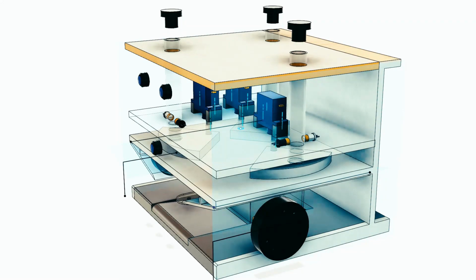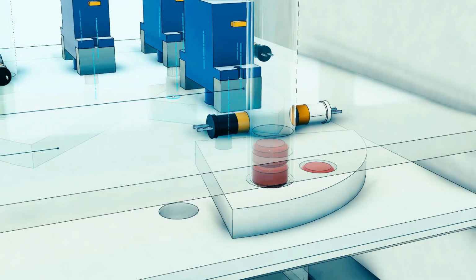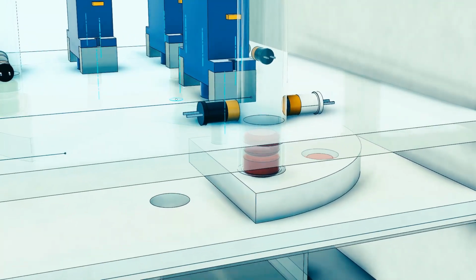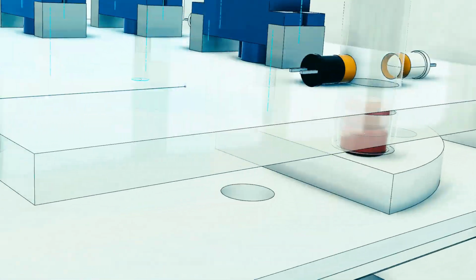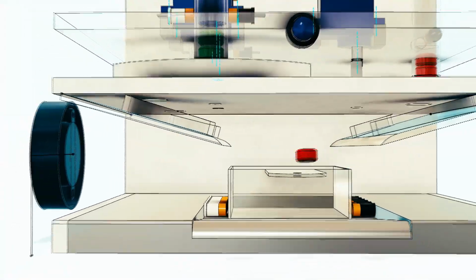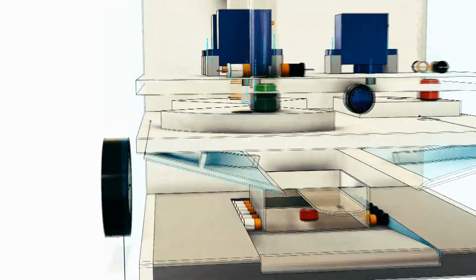As we have already seen the individual components in detail earlier, let's dive straight into its working. Tablets are loaded in their respective tubes. A small quantity is taken here for demonstration. The quarter circle slides out exactly one tablet and drops it through the hole placed 45 degrees apart. The tablet then moves along the inclined slider plate to end up in the dispenser cup. The same sequence is repeated until all the prescribed dosage reaches the cup.